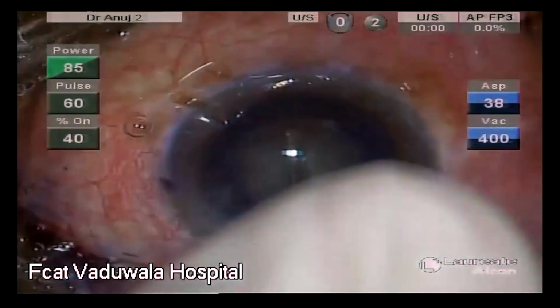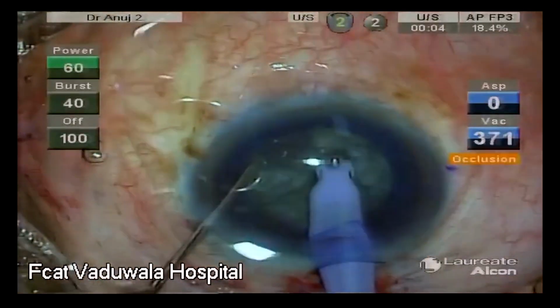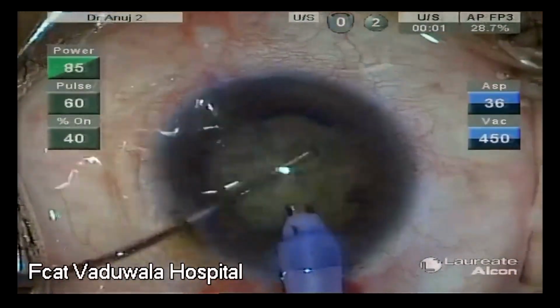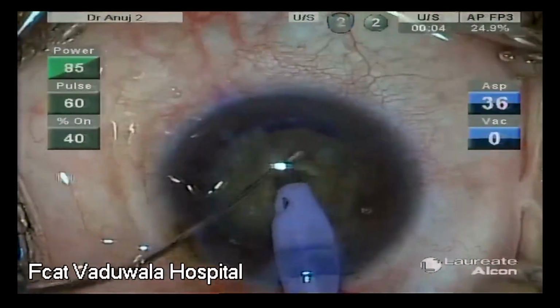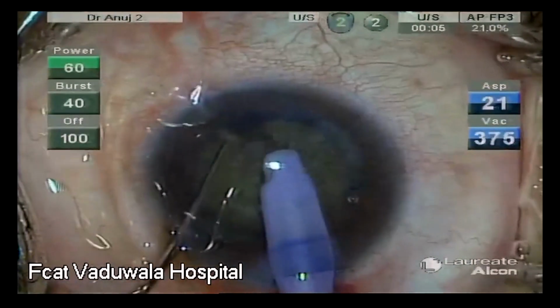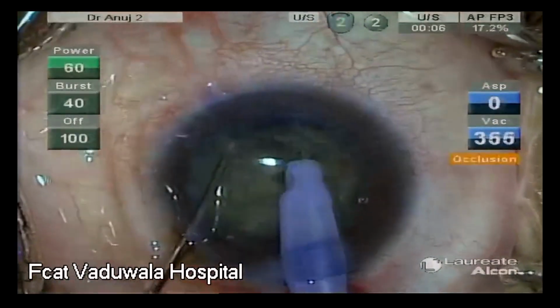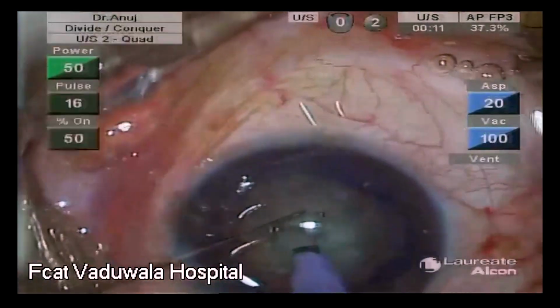This technique is extremely safe as the rhexis margin is never crossed. It has minimal stress on the zonules and the nucleus is cracked within the bag itself. The phaco energy used to create the well is at a much lower plane, and because these multiple equal-sized fragments are being nudged in the center, they occupy the superior empty space of the well, which keeps them at the anterior capsular plane. This results in immediate post-operative clear corneas even in dense brown cataracts.